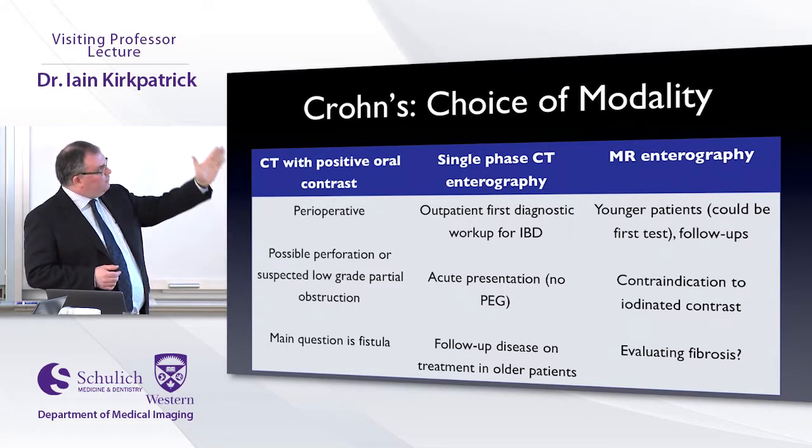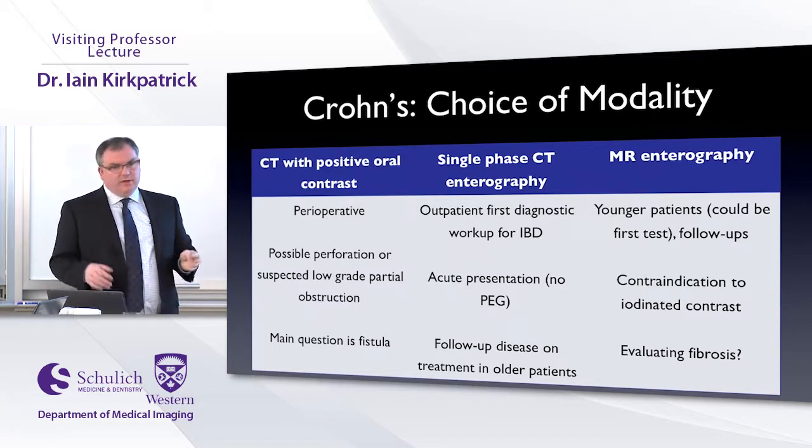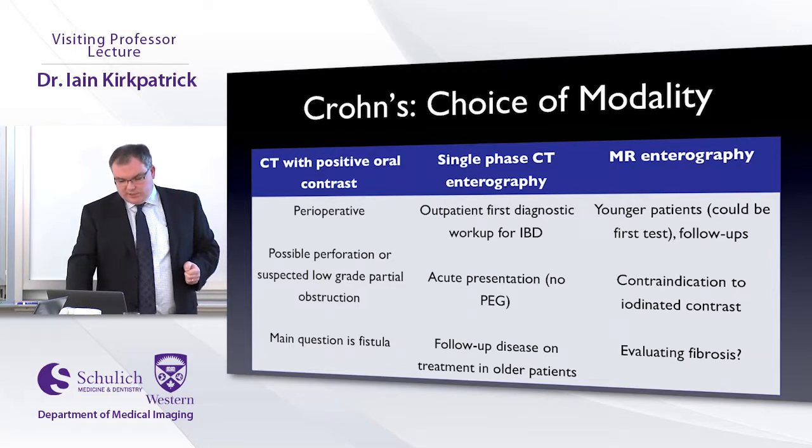But single-phase enterography still has a really important role to play in Crohn's, and I would say for assessing for enhancement, you get such good studies uniformly. It is probably my favorite study to read for these patients.